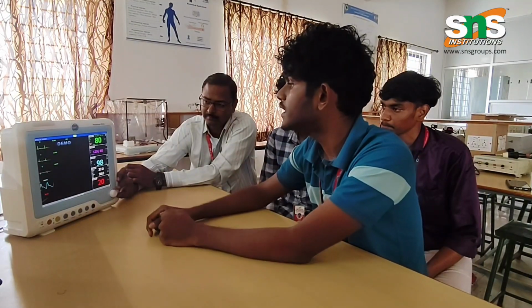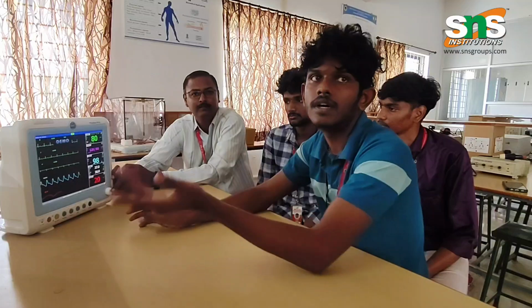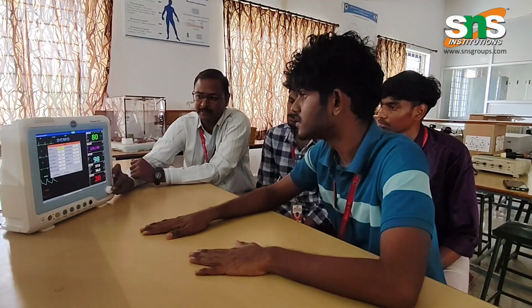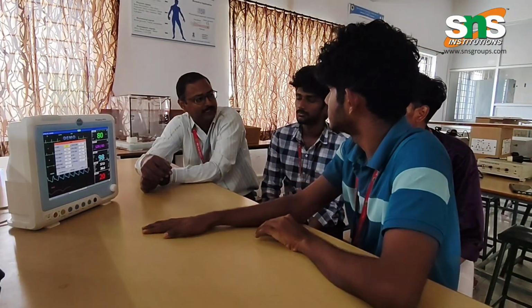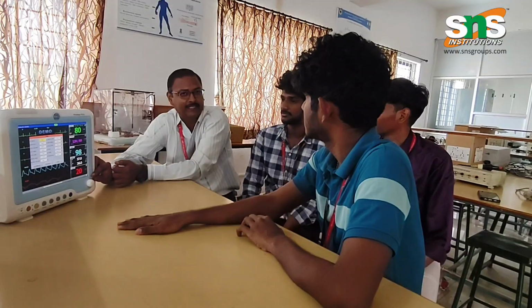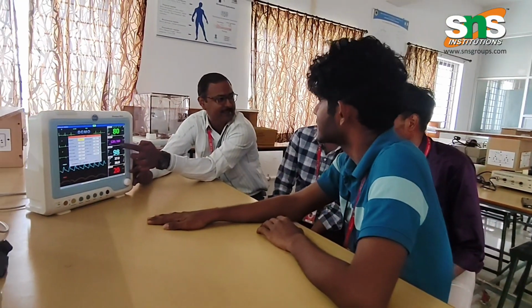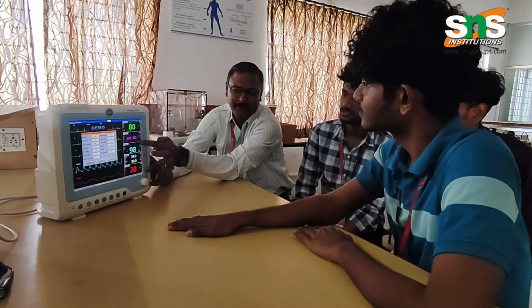Next we are moving to the NIBP. NIBP is non-invasive blood pressure. We have certain numbers. What is the normal BP range? 120/80, systolic and diastolic. That is what you are seeing here, right? So we are setting a value of 120/80. This is a normal range.